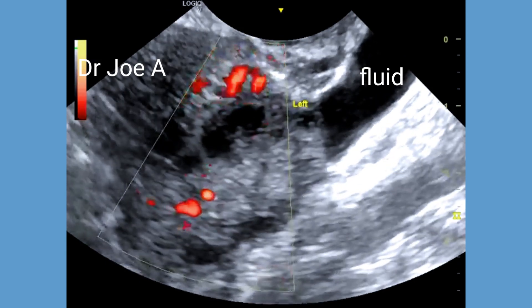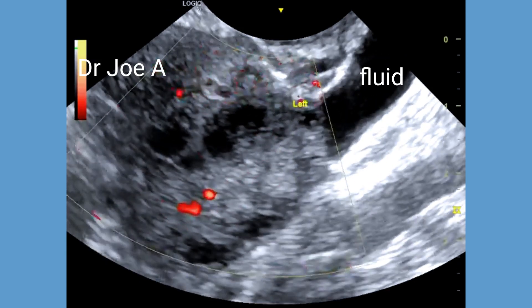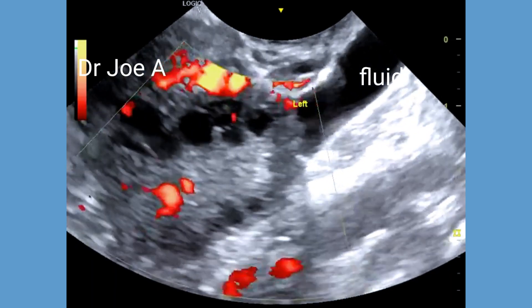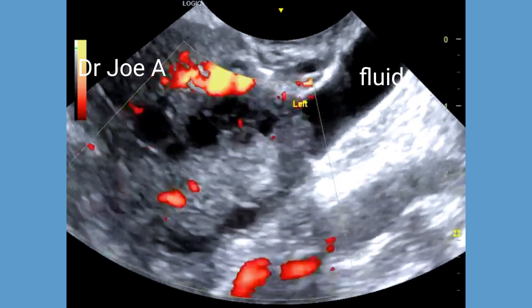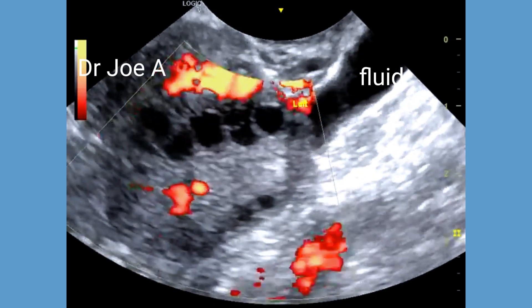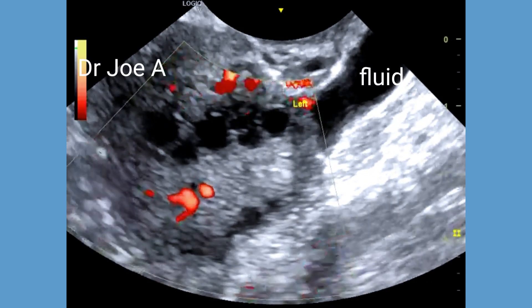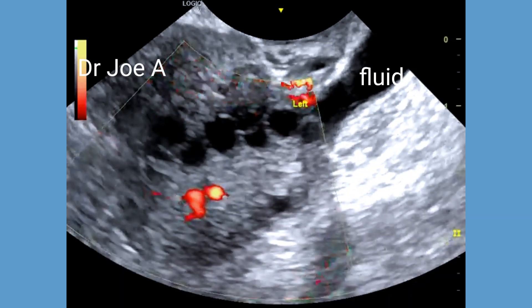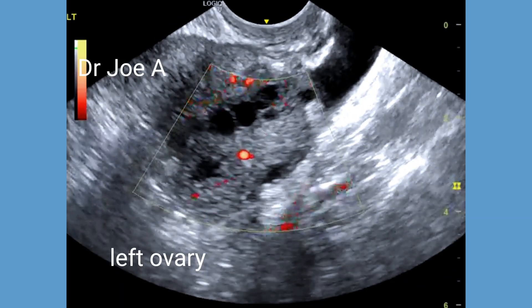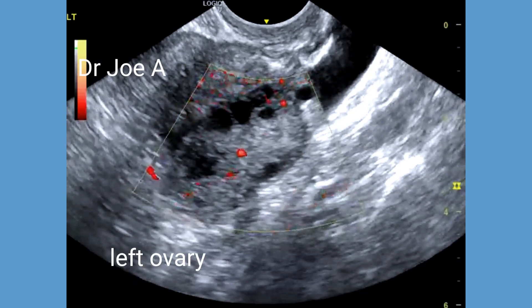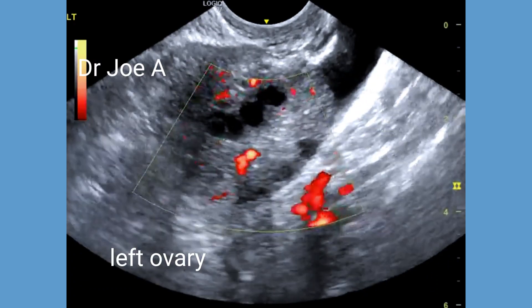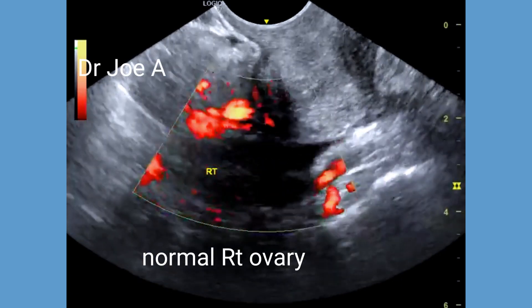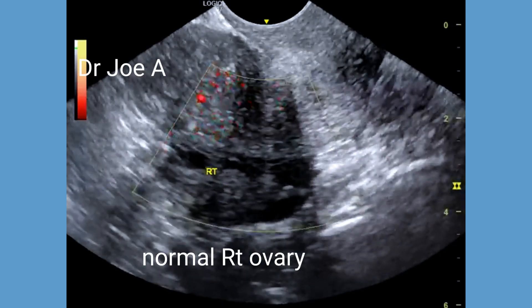Note also the presence of minimal free fluid in the pelvis around the left ovary. Power Doppler shows limited vascularity of the left ovary, suggesting partial or incomplete torsion. The normal right ovary is shown for comparison.